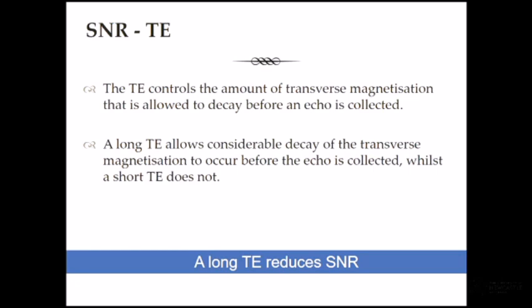Okay? It'd be a proton density weighted image because we've got no evolution of T1 or T2 contrast yet. But as that decays over time, they're fanning out. At the point in time where we measure them, where they've separated, that's what allows us to impart a T1 or a T2 weighted image with what we've acquired.